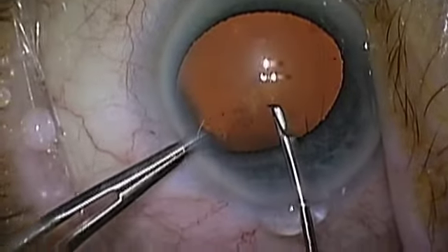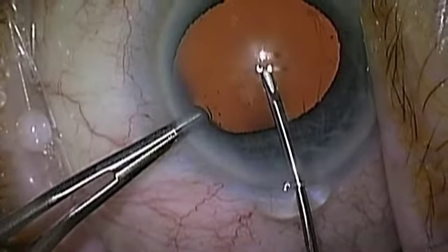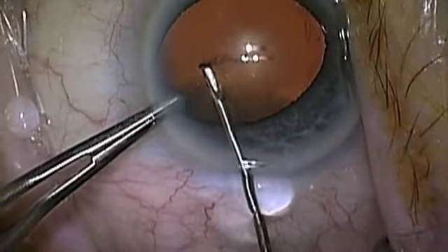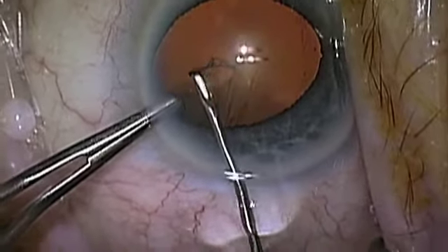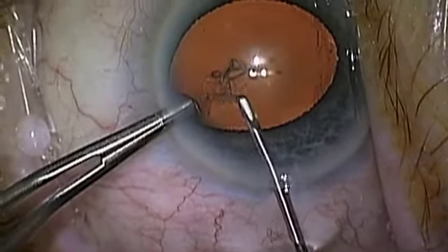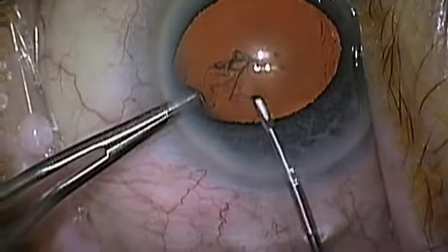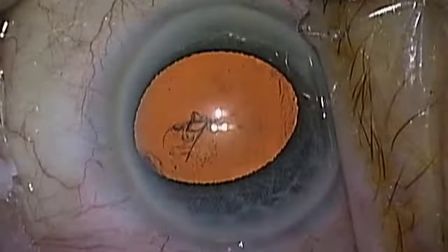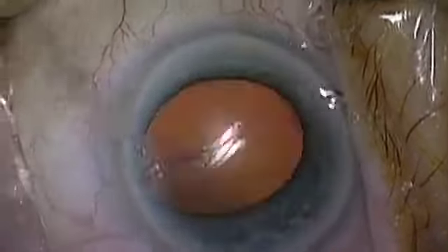Here we see an eye with a nice red reflex. This view is through the operating microscope. The instrument on the right is called a cystotome, and it's essentially a sharp needle, and right now it is being used to make an incision in the anterior capsule. This patient is able to move his eye freely, so the instrument on the left is actually holding the eye still while the capsular flap is developed.